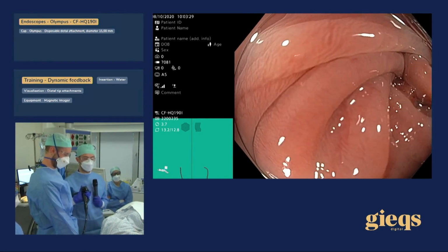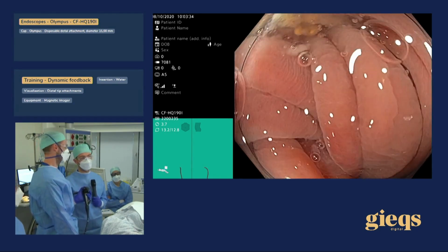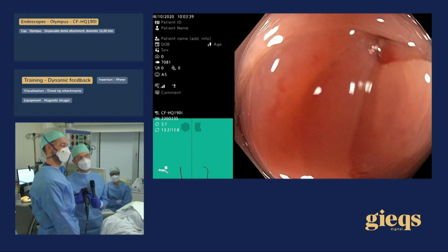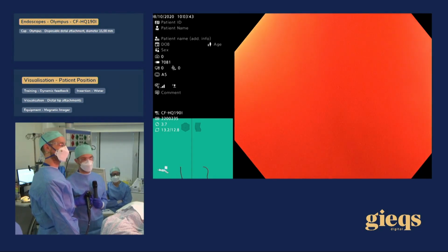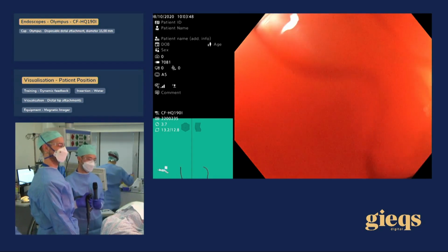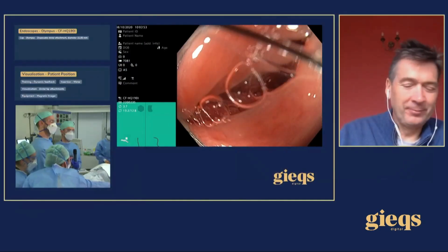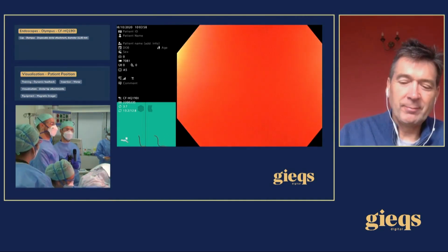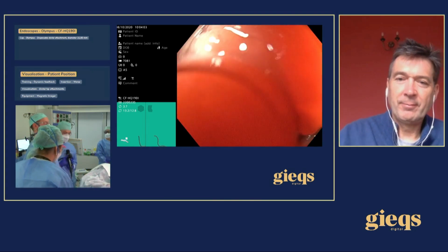So we start here in the left lateral. Okay. I think for the sigmoid, that's a good position. Yeah. But I think turning the patient now, I think maybe John and Roland would agree, would be something to consider to enhance progression. So let's do that. Okay. To the back. Other patient. So do you agree with that, Christophe? Or were you quite happy with them in the left lateral? Yeah, maybe to just... Normally I start in the left lateral, and then maybe when I'm past the sigmoid, turn to the supine position.